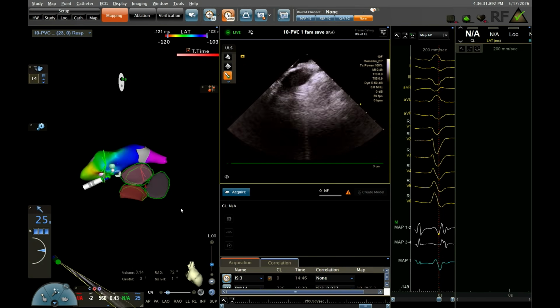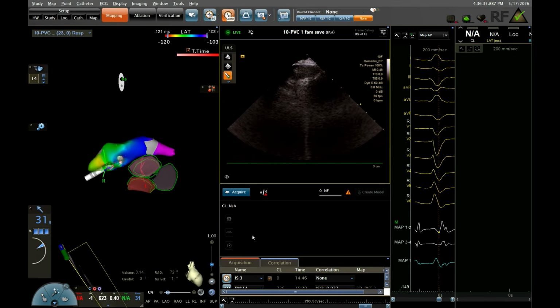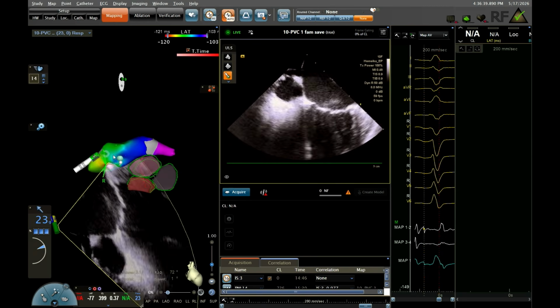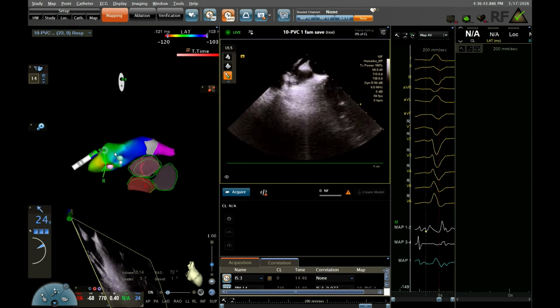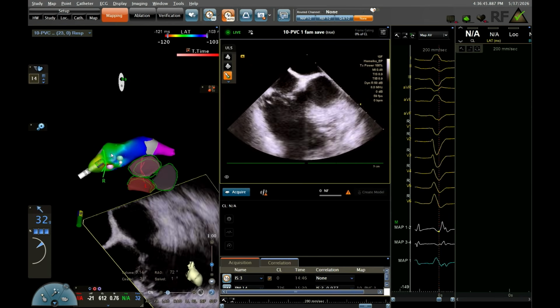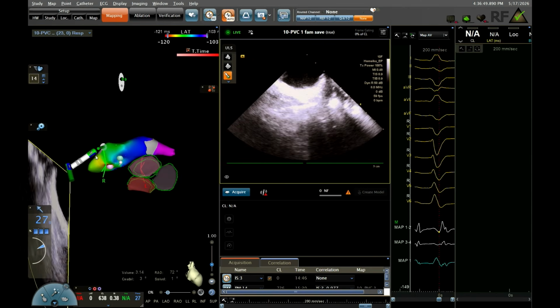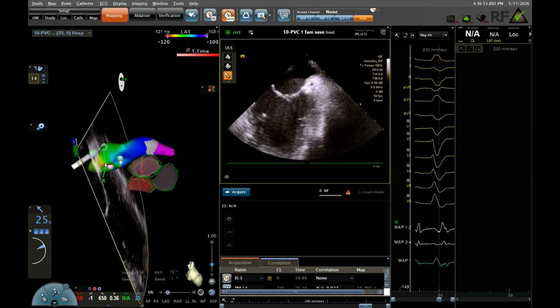This is how you advance ICE in the left atrium, by the way. You find your wire. We have it right there. Just one second. Yeah. Can you please remind us, that's ICE. We just advanced ICE. The last ablation onto the patient's left side, he also received ablation in the great cardiac vein.